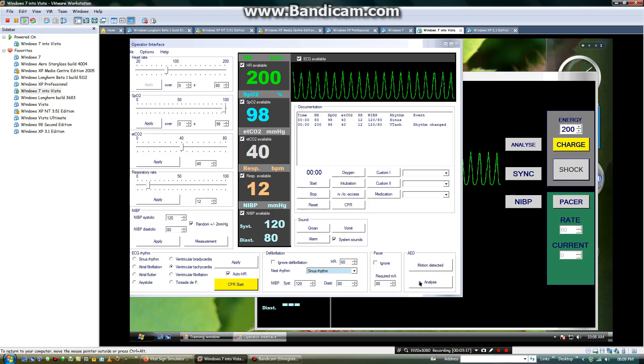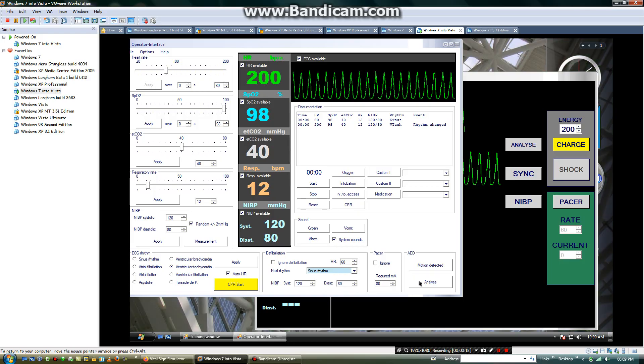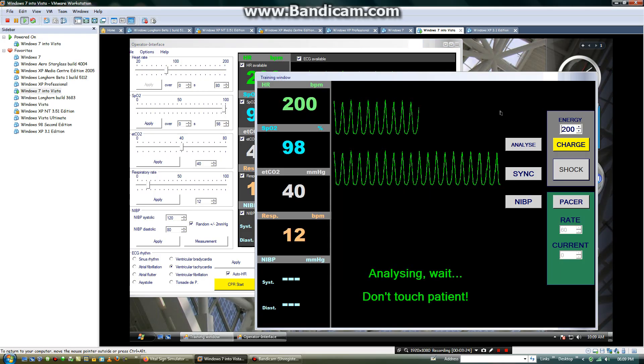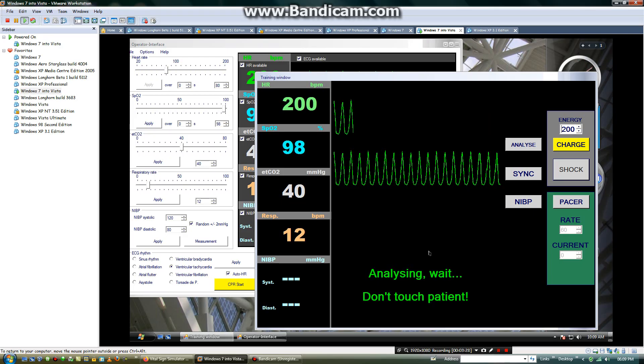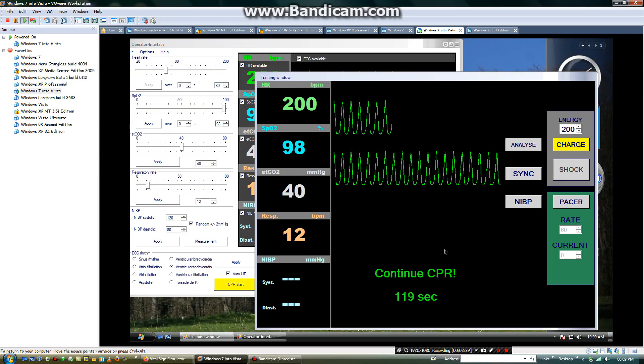Then, I will analyze the patient. It's going to be analyzing. Analyzing. No shock advised. Continue CPR.